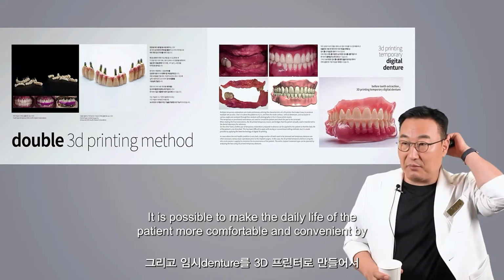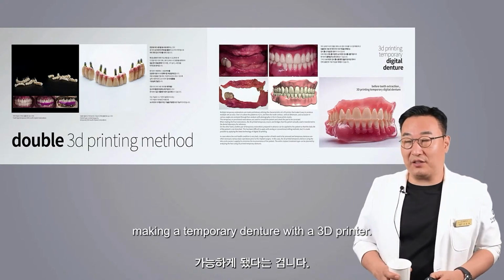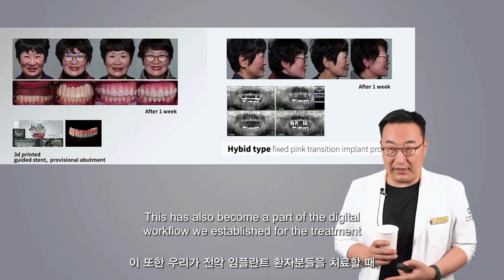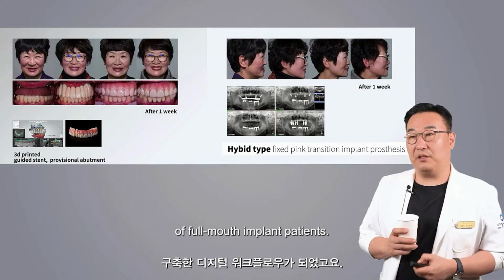It is possible to make the daily life of the patient more comfortable and convenient by making a temporary denture with a 3D printer. This has also become a part of the digital workflow we established for the treatment of full-mouth implant patients.